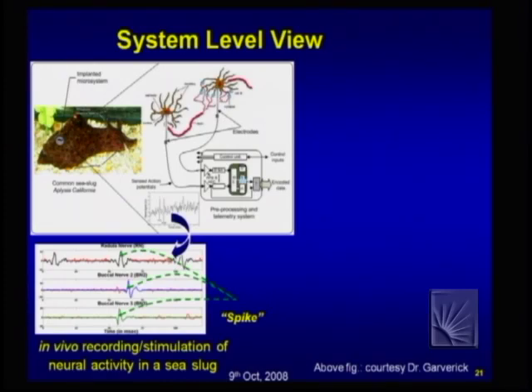So, let us look into the system level view of an implantable system. This came out of my collaborative work with Professor Hillel Chiel, Professor Garverick and Professor Masoud Tabibazar. What we did is develop an implantable system to monitor the neural signals from the ganglia of a sea slug, an invertebrate animal, which is a very good test bed for studying the hardware and algorithms for neural interfacing.